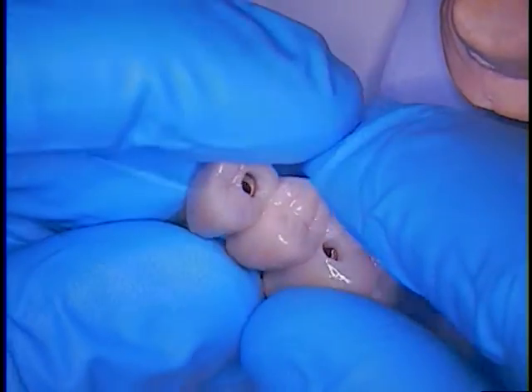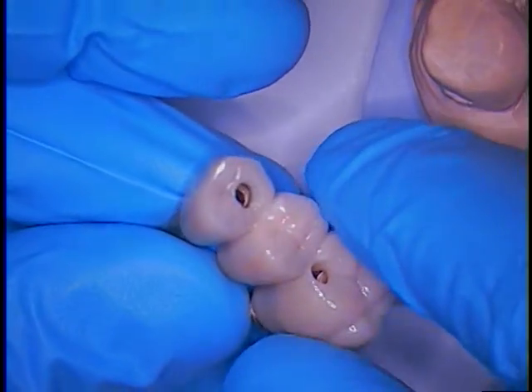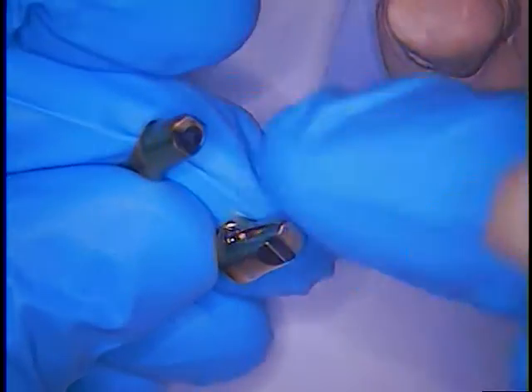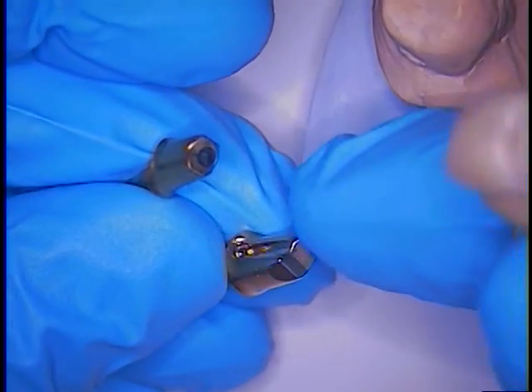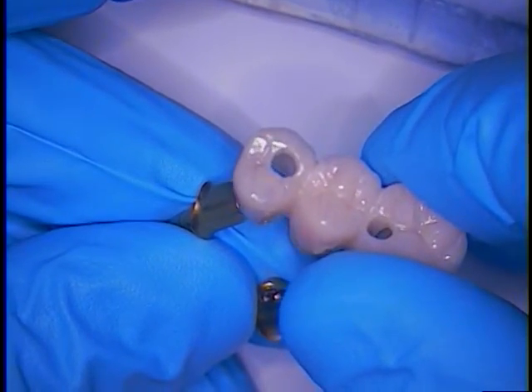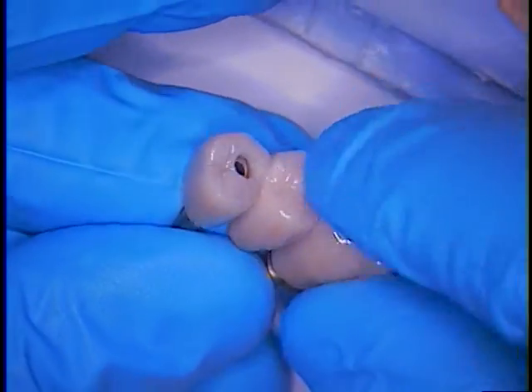Why do we do it this way? Well, what if the color wasn't right? What if the bite wasn't right? What if we had to add a contact? If we go back to the lab, it's not a cemented case where they have to reheat it in an oven and try to remove each component, which can also oxidize in the oven. You really don't want to subject your abutments to another situation in the oven — why not leave them pristine? This can always be remade by your lab or added to with add-on porcelain, or if they have to change the color.